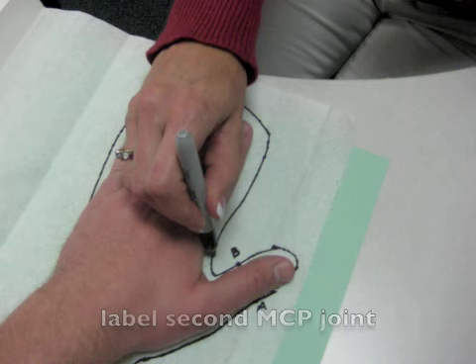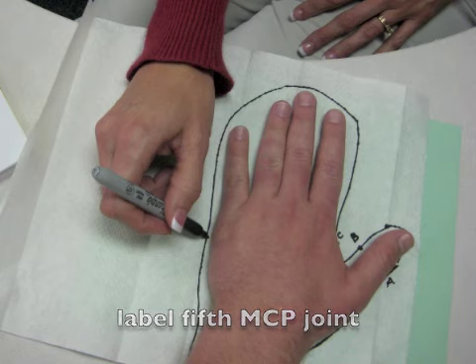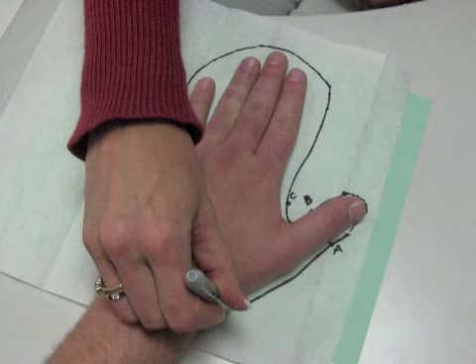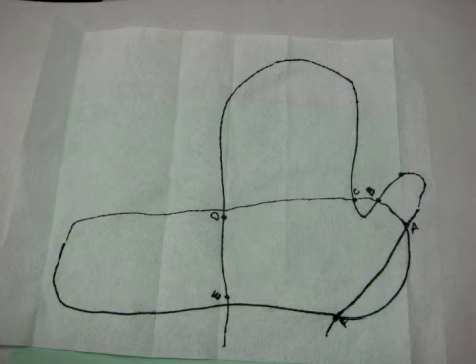Next, mark the MCP joint of the second digit and label it C. Mark the MCP joint of the fifth digit and label it D. Mark the wrist joint on the ulnar side and label it E, then on the radial side and label it F. Have the client remove their hand from the pattern. Starting with A, draw a curved line down to F, then draw a line from F to E. Draw a line out from E so that the pattern is twice as wide as the hand, curve the line up and around and connect back to D. Then draw a line connecting D to C, C to B, and B to A.